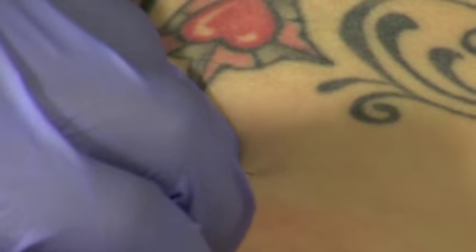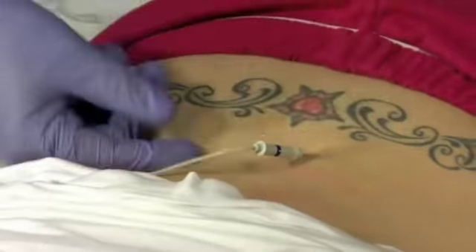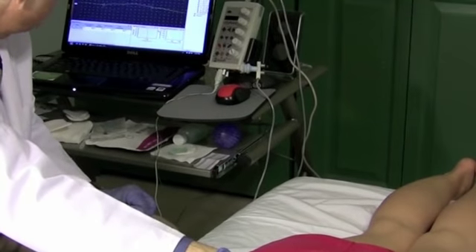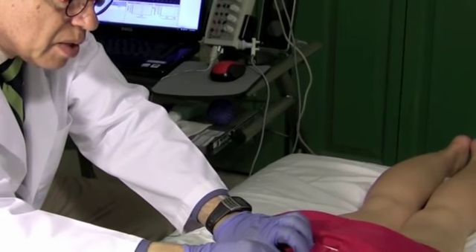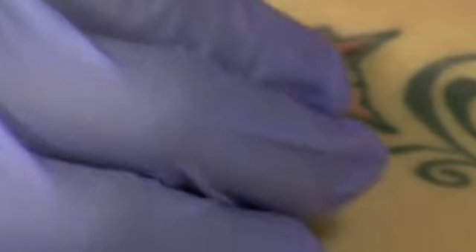It's going to be a stick here. That's it. Relax. That's L5. Here we go. That's L5, and that's normal. And then 2 finger breadths below that, that's S1. 1, 2, 3. Relax.